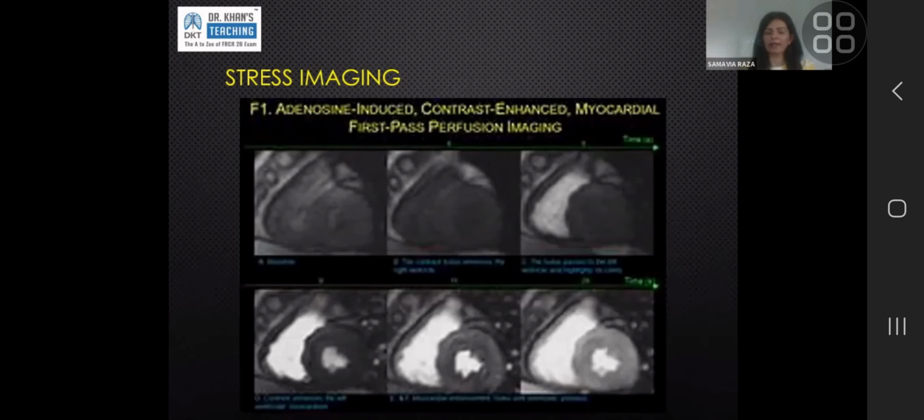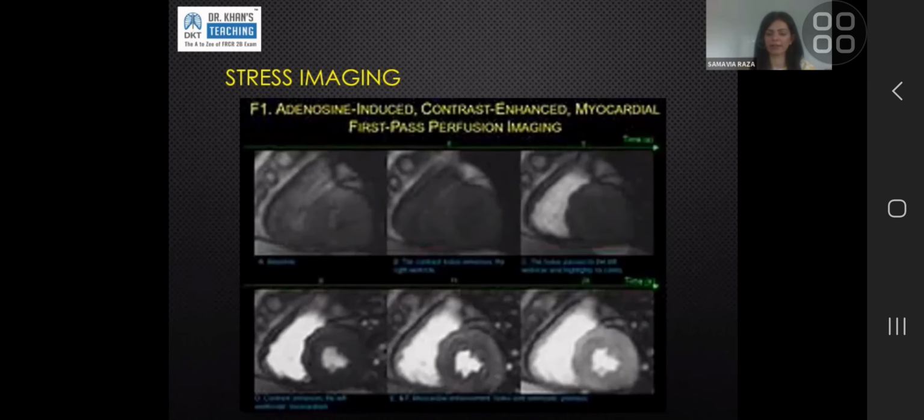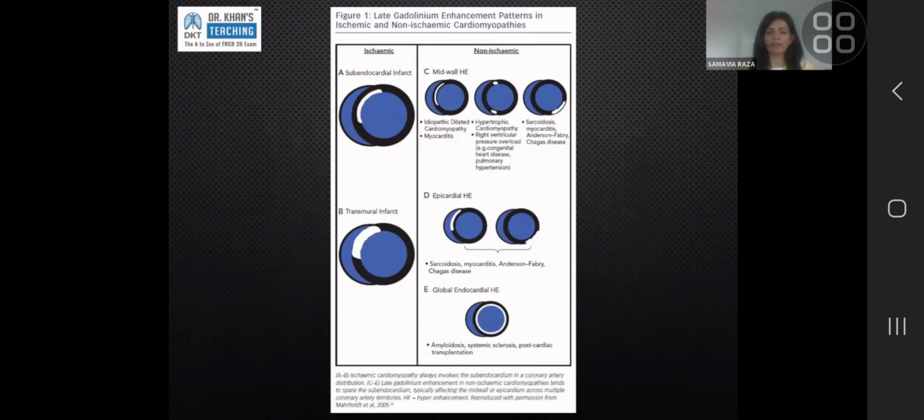The symptoms they get are ischemic symptoms. They get chest pain, they get tightness, they get breathlessness, and you can usually tell by looking at the patient that they're feeling it. So a radiologist or a cardiologist would be injecting, standing next to the patient, watching their heart rate, and then telling the radiographer, go. I can tell that the adenosine is acting. Once the images are acquired, you stop the injection straight away, because like I said, it is a dangerous drug, or it can be.